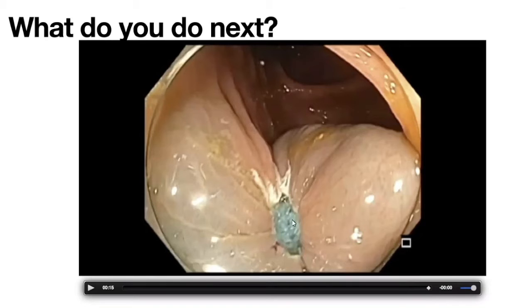The other thing is, so one is you look at the depth of the resection, and the second one is you want to document that the margin is clear of any polyp. When Noria said it looks clear, basically there's no residual tissue. And if there is a concern about residual tissue and it is macroscopic, that is quite obvious, then you want to consider resection rather than ablation. And in lesions like this, when there is a clean cut with a clean margin, I don't ablate. But if there is piecemeal resection, I always ablate, and I try to do that with an APC. Although recently, snare tip soft coagulation has been shown to be very useful as well.